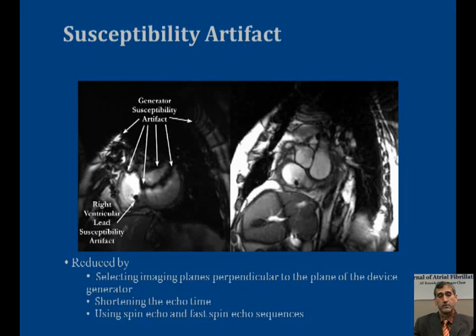acceptable image quality. Some examples that hopefully you'll be able to see along with this talk include this image of a patient with a transposition of great vessels, which is very adequate for merging with an EP navigation system or for hopefully real-time use, and also an image of delayed enhancement showing some septal scar in the setting of non-ischemic cardiomyopathy.